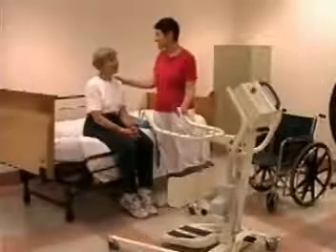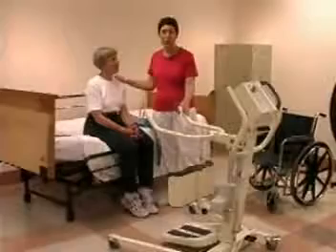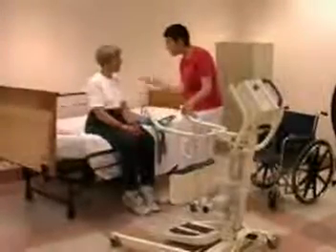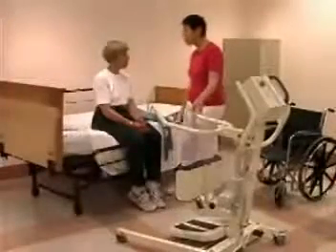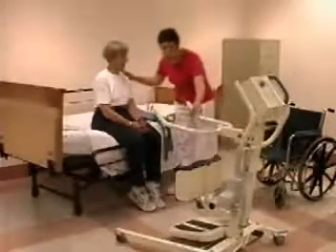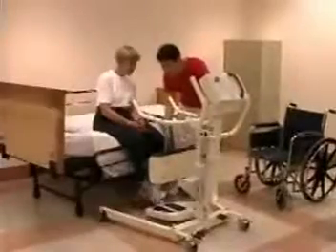Our patient, Mrs. Johnson, and I are now going to demonstrate the standing lift for you. Mrs. Johnson, this lift is going to lift you up from the edge of the bed over to the wheelchair. It's going to be comfortable and safe, and I'm going to explain exactly what you need to do. First of all, I'm going to be moving the lift closer to you, and I'd like you to put your feet on this platform.